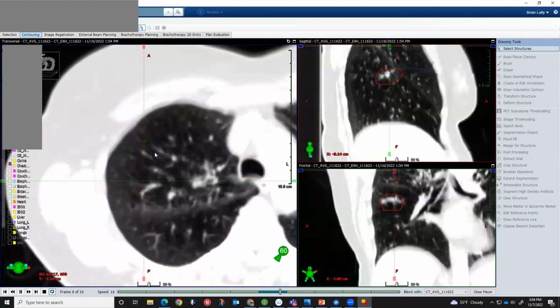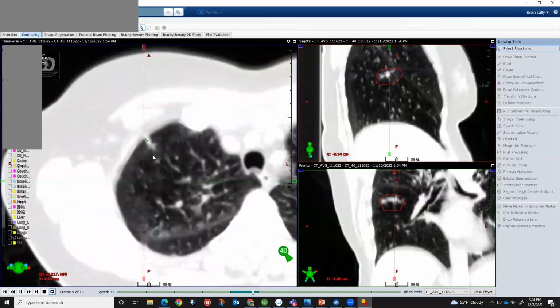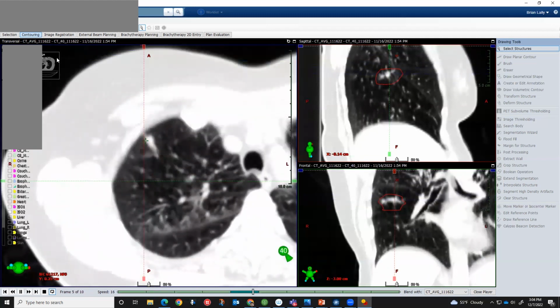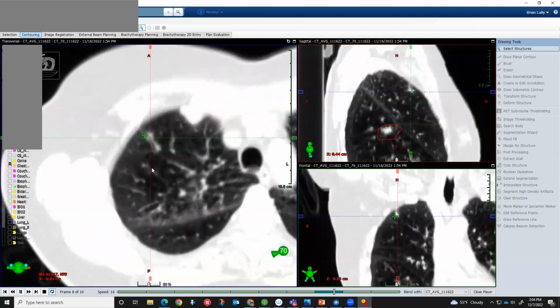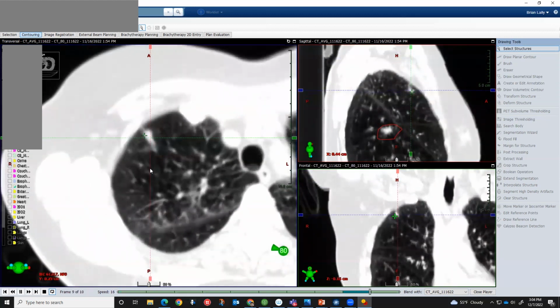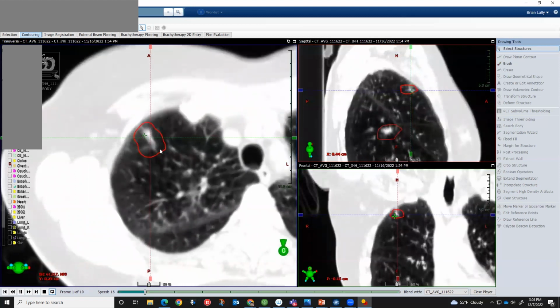As we go higher in this patient, there's a second lung cancer that we want to treat. I'm going to zoom in on this one. This one surprised me a little bit because I was expecting this to be real stable. There seems to be actually a fair amount of motion in a circular direction, not as much as up and down, when I was going through and looking at this one at the different phases. So this one here, we then were able to contour out and figure out where it was in different spaces to make sure that we were able to cover it.